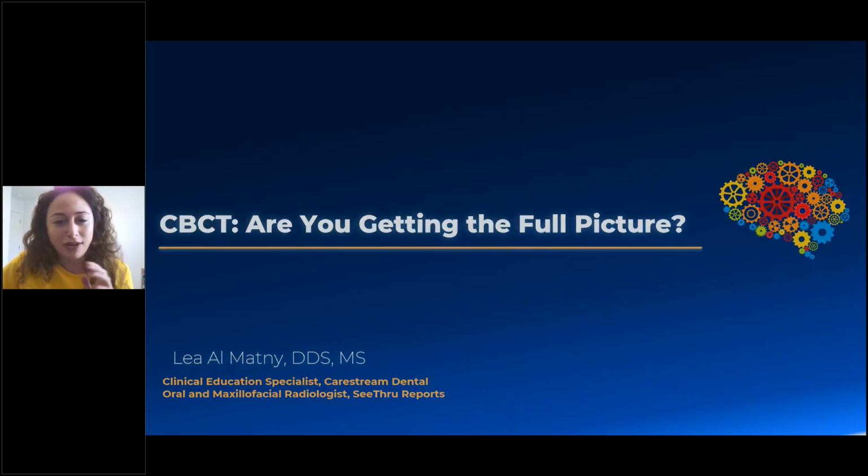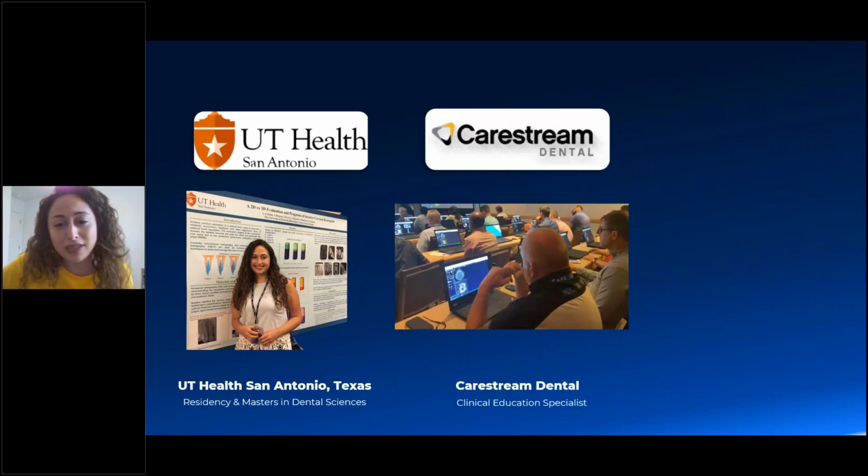Before I start, I know Tammy already introduced me, but I think there aren't many people who work with radiologists, so I wanted to tell you a bit about what I do every single day. I graduated from UT Health San Antonio, and in residency, my goal was to make sure that I know how reports can help you in your practice, how cone beam can help you in your practice, and not just to learn the radiation physics and biology part of it.